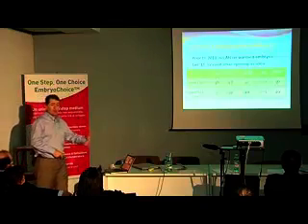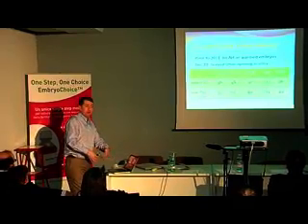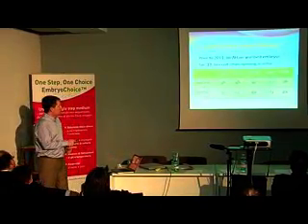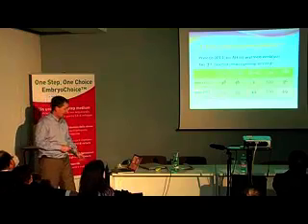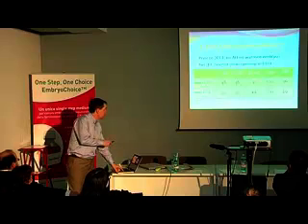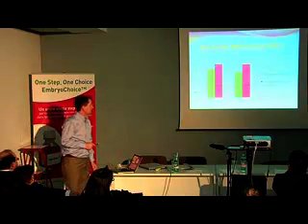So now I'm a big advocate of not only shrinking the embryo before you vitrify it, after you warm that embryo, you should make a hole in the zona so that you negate the hardening of the shell, and we've seen a nice jump in our pregnancy rates as a result of that process.